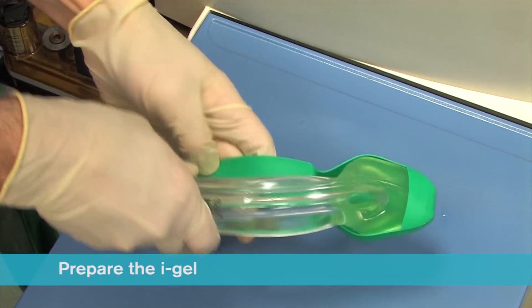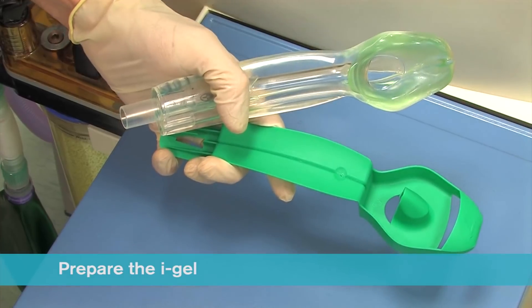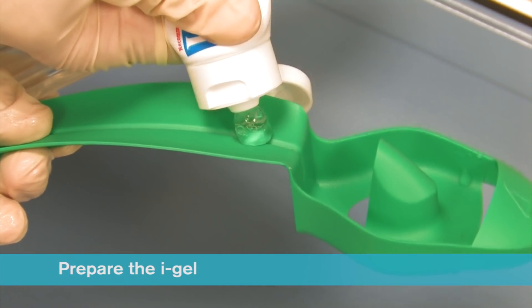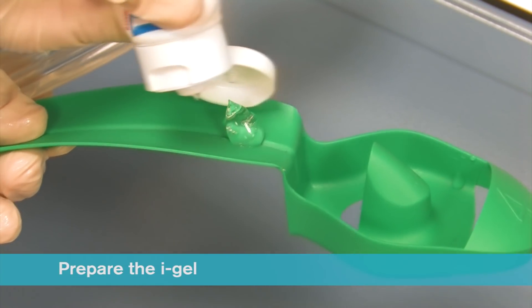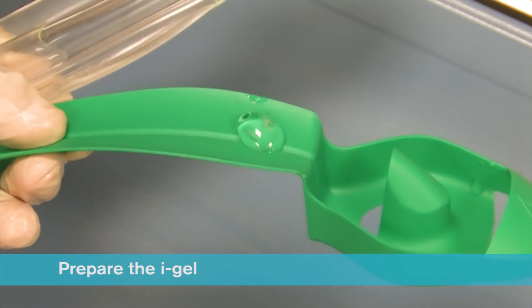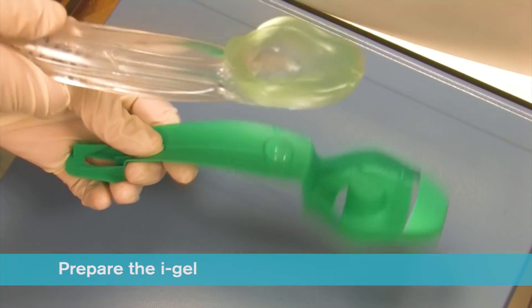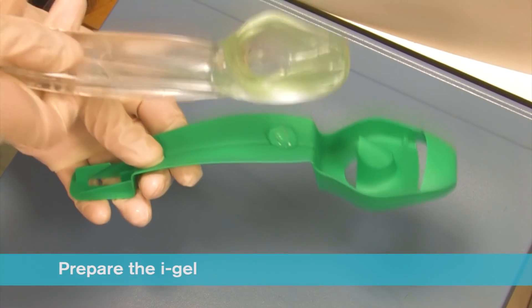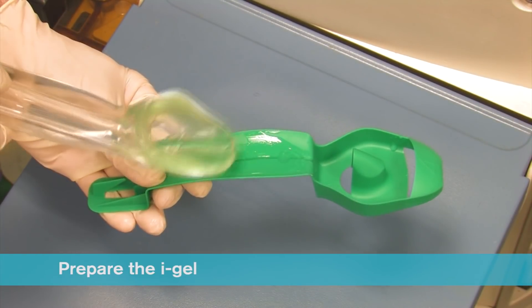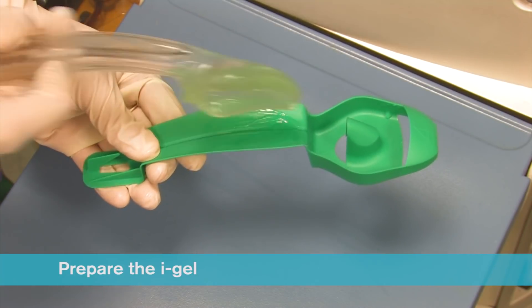In the final minute of pre-oxygenation, remove the iGel and place a small bolus of a water-based lubricant such as KY Jelly onto the middle of the smooth surface of the cradle or cage pack in preparation for lubrication. Do not use silicone based lubricants. Grasp the iGel with the opposite free hand along the integral bite block and lubricate the back, sides and front of the cuff with a thin layer of lubricant. This process may be repeated if lubrication is not adequate.